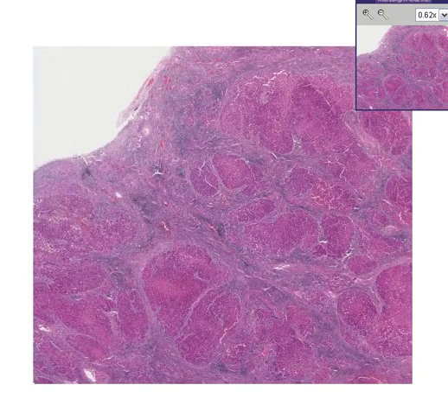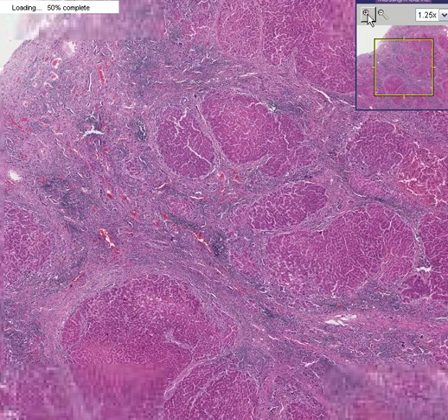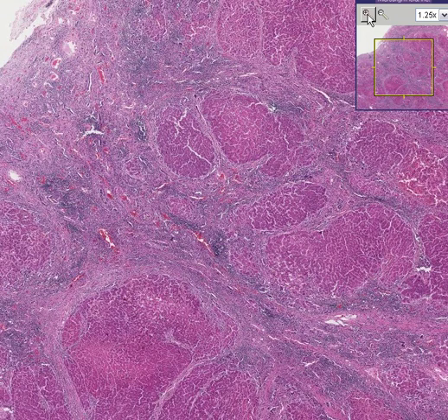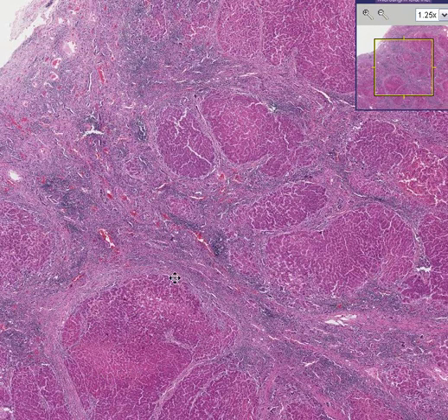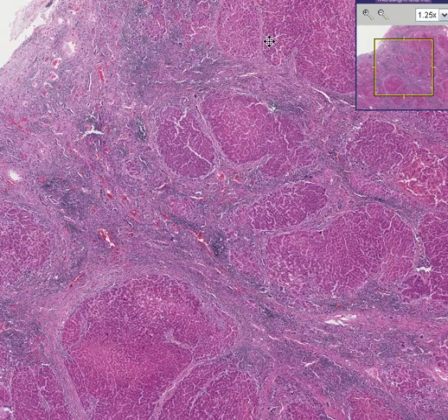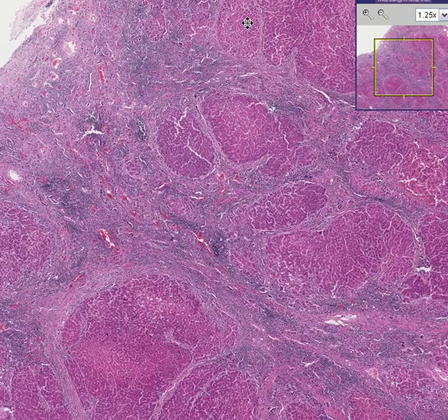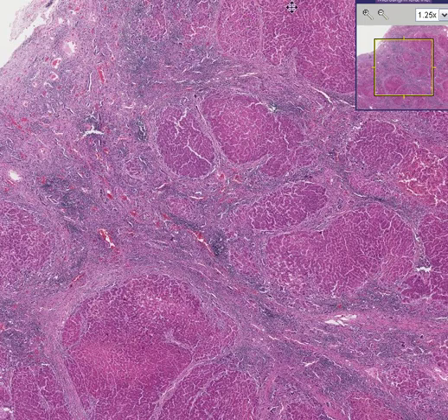Here are the two things I want to say about cirrhosis. It doesn't matter what kind of cirrhosis, or what adjective you put in front of the word cirrhosis, or what the cause is — all cirrhosis is two things. Number one: irregular regenerating nodules, like you see here throughout the specimen. And number two: dense fibrosis, or sclerosis, between these nodules.